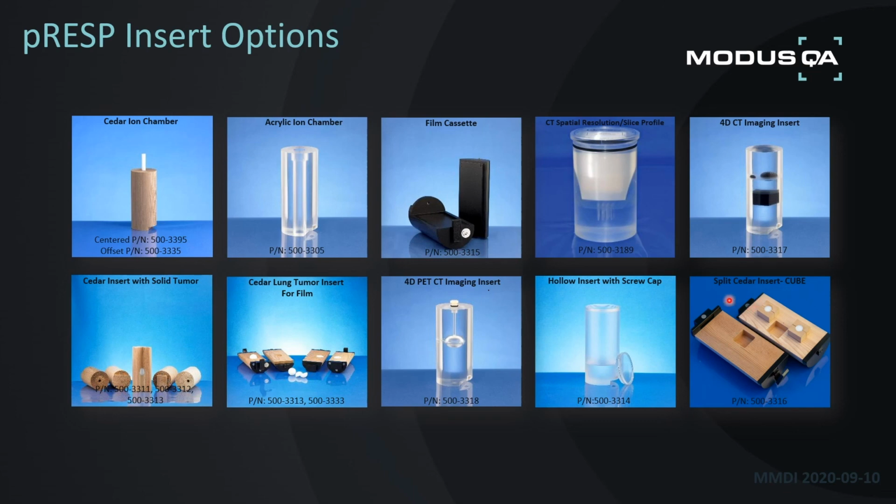And we do offer specialty inserts where, as an example, we've had requests from Synchrony customers for a tracking module. There's different features that we can provide for customers. So if you're considering a pRESP Phantom and you don't see exactly what you're looking for in terms of an insert, definitely ask us, because we have the ability to make things for our customers or to make sure that they have all the tools they need for QA. As an example, if you needed to have OSLDs drilled into one or TLDs, we have the capabilities to provide that for you.